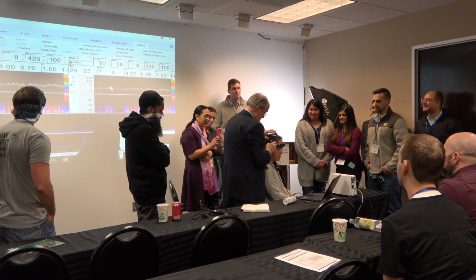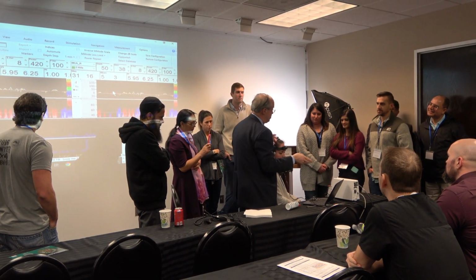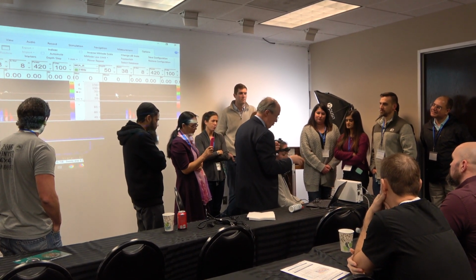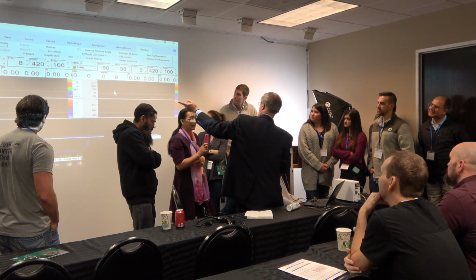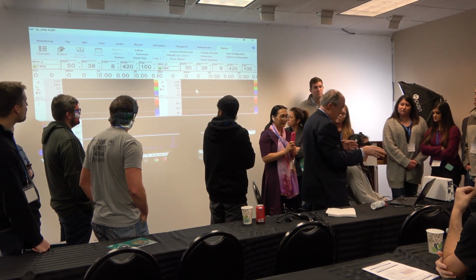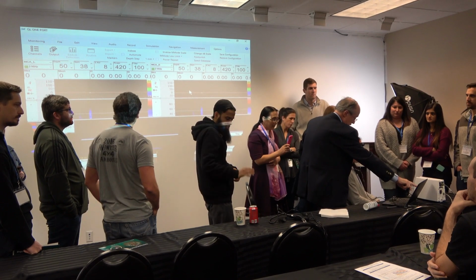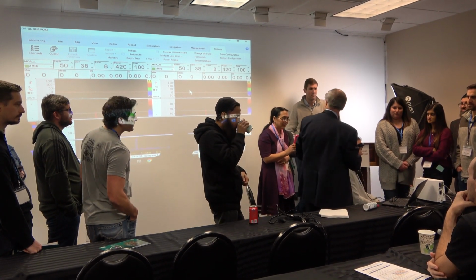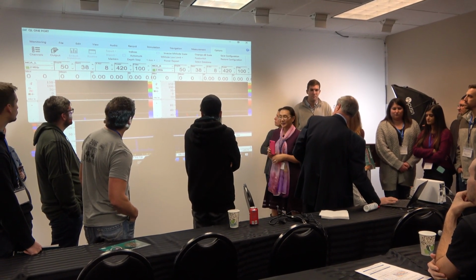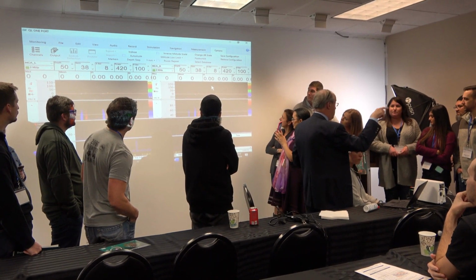And again, they put a relatively new software on this machine, and today when I tried to run it I had some problems. So usually, of course, as you can see on the screen, you can have right MCA, left MCA, all right? And you can run a script. One of the great advantages of all contemporary TCD units is that they have... Here we have the upper screen where we will see a regular Doppler spectral waveform, all right?